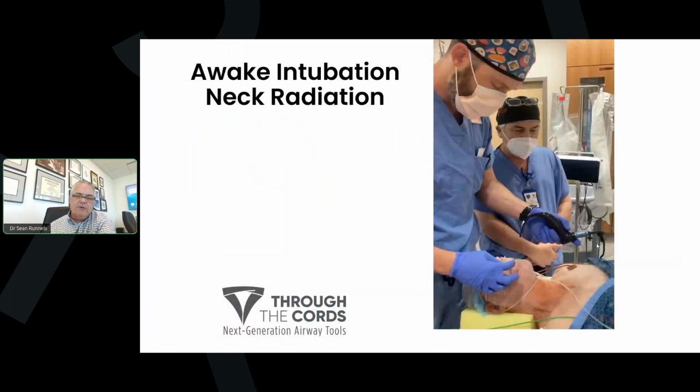This is an awake intubation to walk you through how the device works. This patient has neck radiation. He's been intubated a few times and is known to be difficult, and classically gets awake fiber optics. Cam Norris is now an attending, but he was a first-year resident and had not done awake intubations before. This patient was numbed up with simply nebulized 4% lidocaine for 10 minutes, and then he got 1 cc of fentanyl and 1 cc of midazolam, and tolerated the procedure really well.